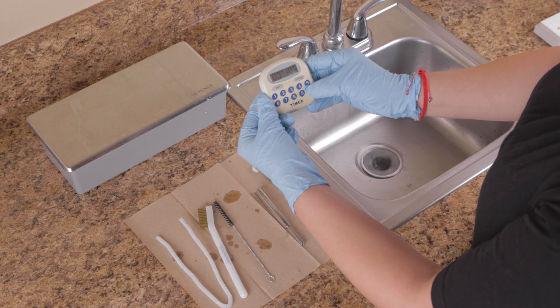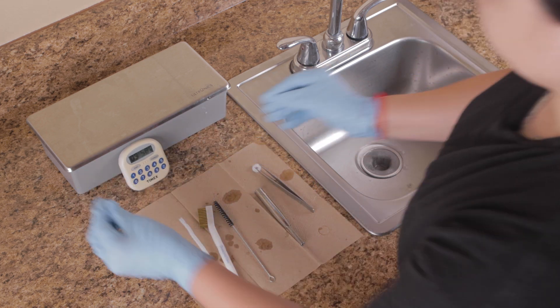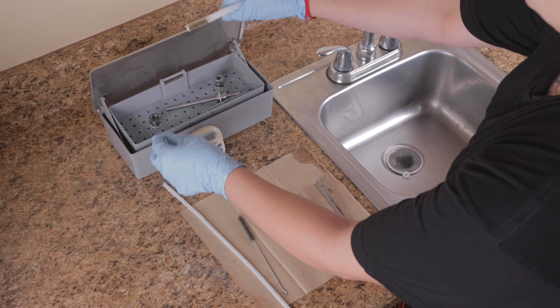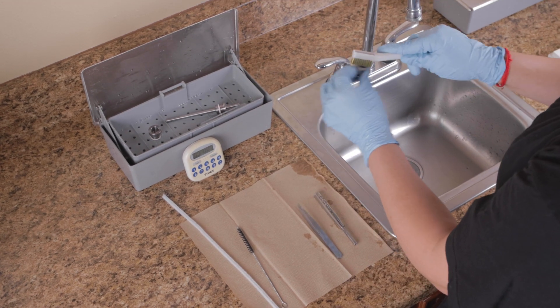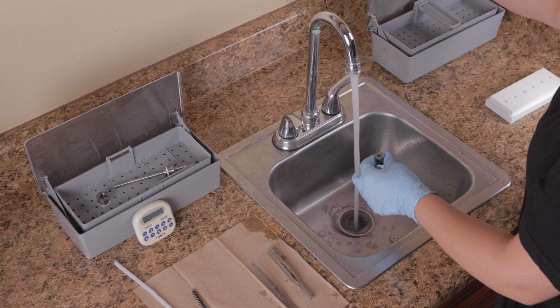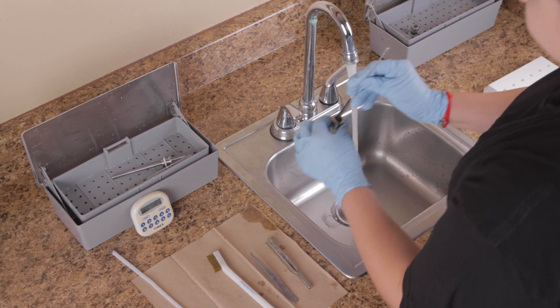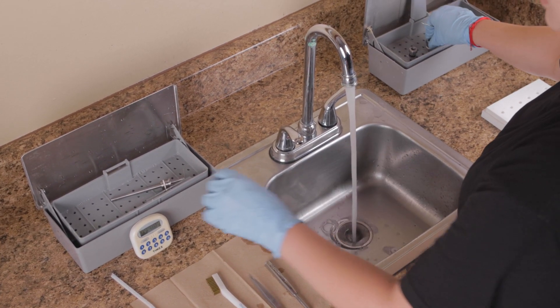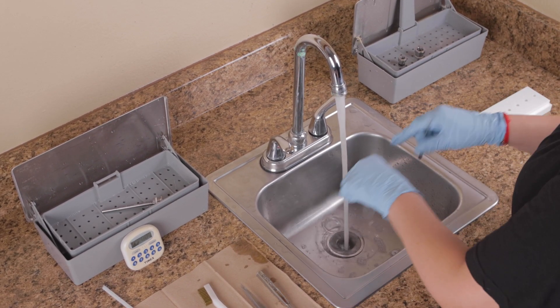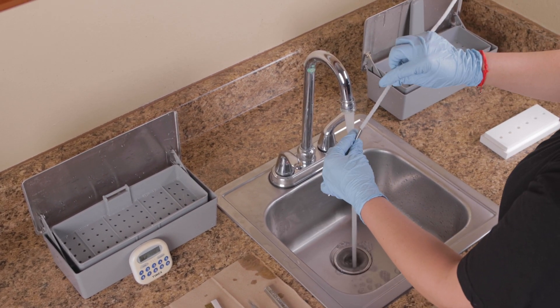Soak all hydro wand components in enzymatic solution for 10 to 15 minutes. Remove the components from the enzymatic solution and scrub the hydro wand tip with the brass brush using soap and hot water. Clean the stem with the pipe cleaner and rinse.